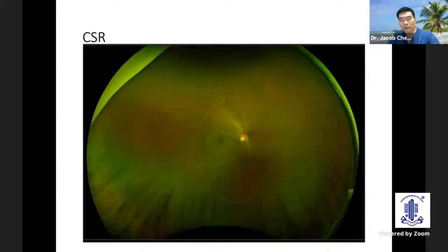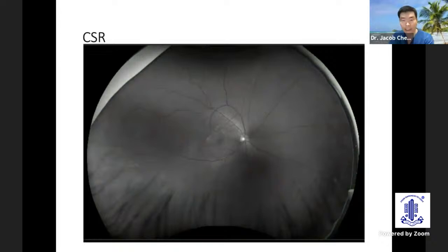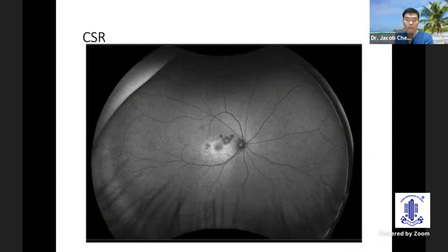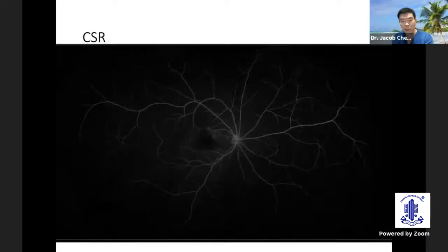How about CSR? CSR, we do see quite a number, nothing much in the periphery. On the green channel, you do not see retinal pathology. But on the red channel where you highlight the choroid, we can see there's probably a bit of hypervascularity of the choroidal blood vessels. However, more instructive would be autofluorescence, where you can see the hyperfluorescence on the AF.